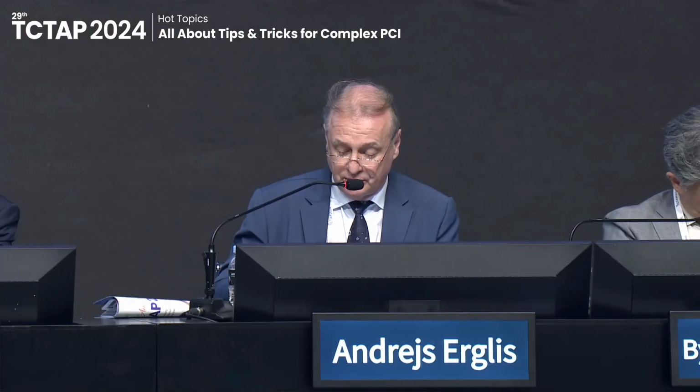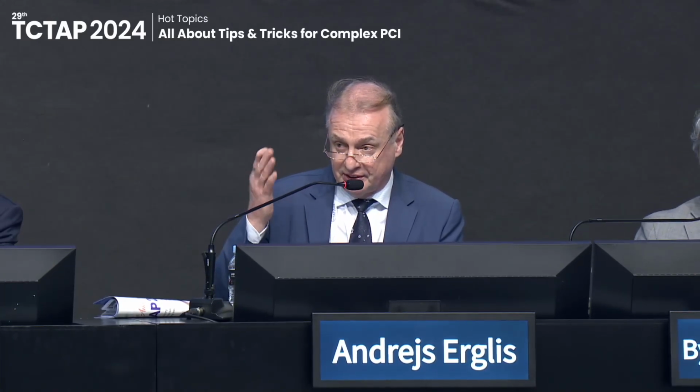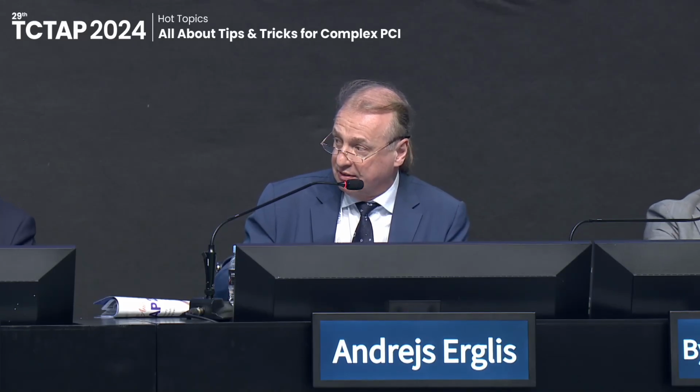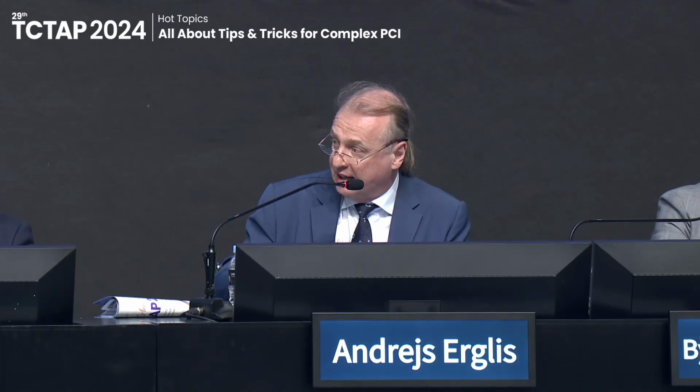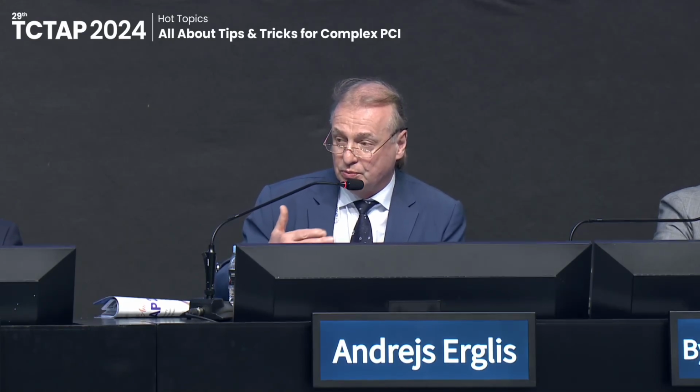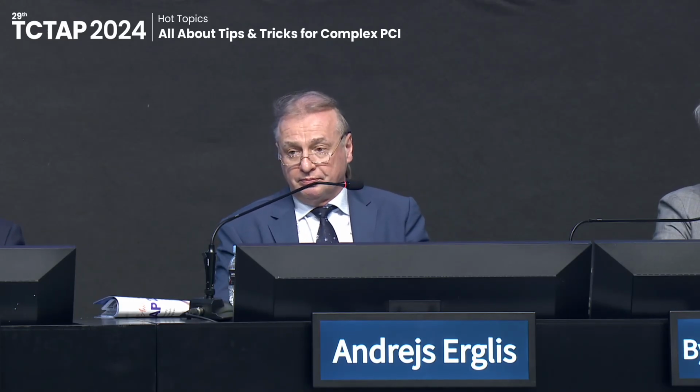Absolutely agree, but what I also wanted to stress is that for all devices, and they showed us very well the data about IVL, it works if you have real vessel dimensions, and you treat a vessel media to media, or whatever, but this is so important. That's why we need to use more and more intravascular imaging to choose which device to use. Okay, thank you very much.